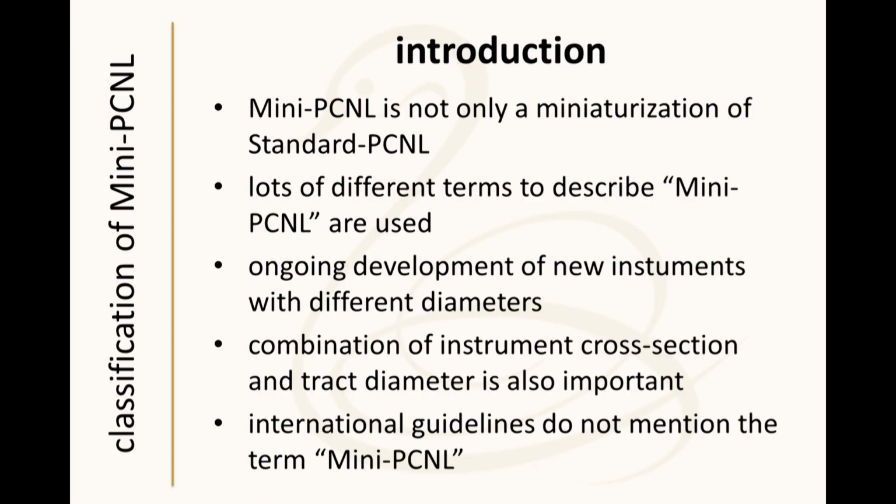The introduction of mini PCNL was in 1999, and since then we have multiple different instrument diameters which are all called mini PCNL. And another important point is that the combination of the instrument cross-section and the track diameter is very, very important, which means we should not only talk about the diameter of the mini PCNL.